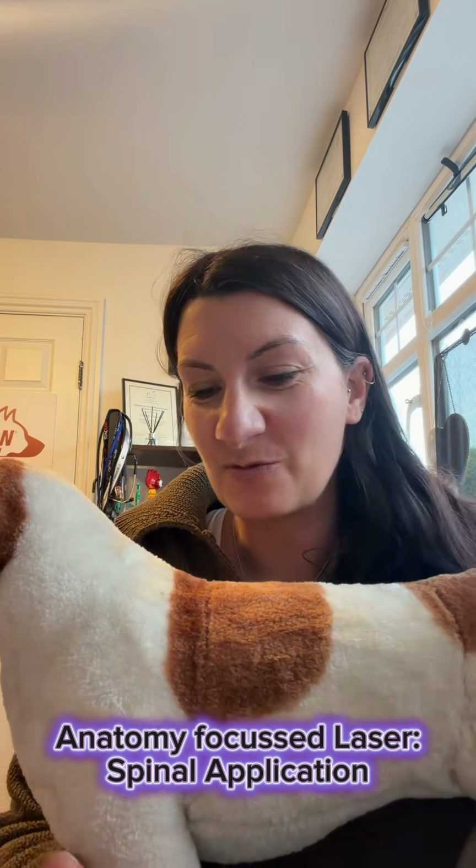Hey guys, so we're on our next episode in our anatomy focus laser series, and we have looked at the anatomy of the spine, we've looked at common conditions. How do we now effectively treat?